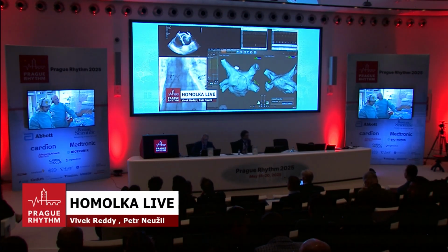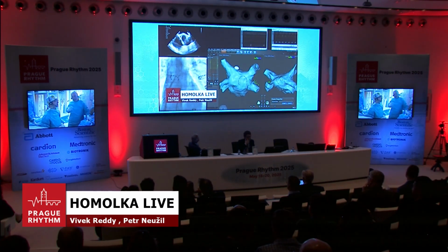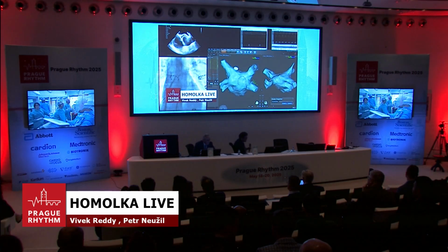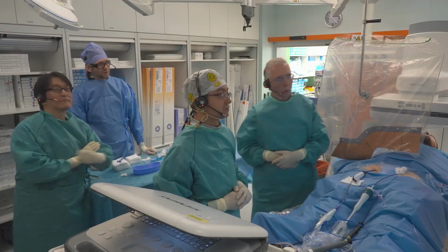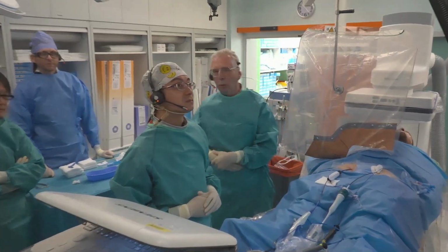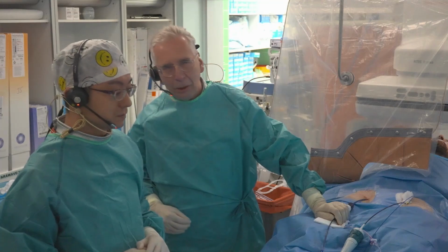Okay, so guys, we have a 52 years old guy who looks like 42 years old, and actually he's with paroxysmal atrial fibrillation, and I was asked to replace Atul Verma, who is like, I mean, mentor for Pulse Select technology. So we will show you the Pulse Select technology for the paroxysmal atrial fibrillation patient.